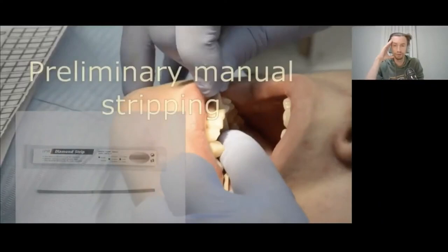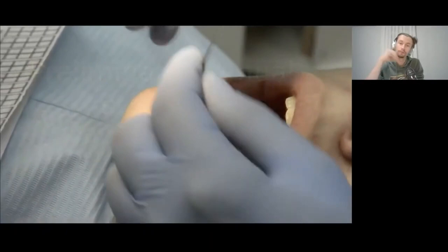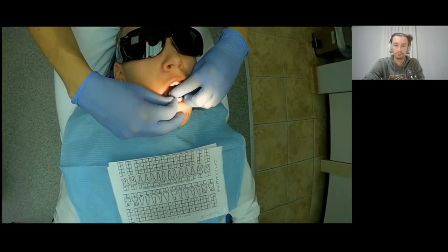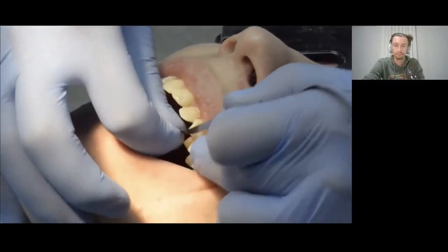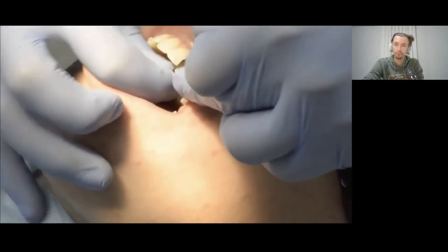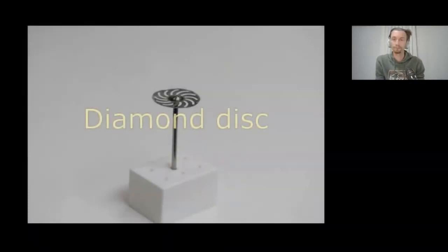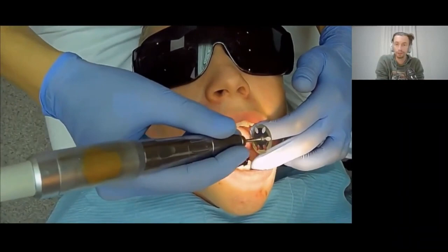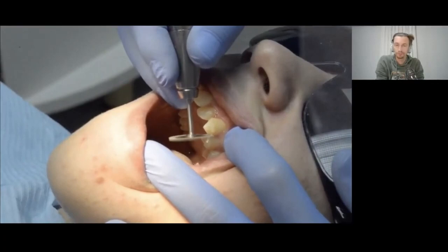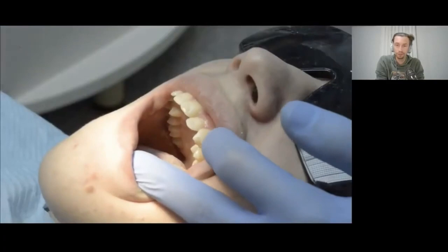Let's have a look at a short video I recorded in the clinic. I place the patient in the supine position, I'm at 12 o'clock, and I put the IPR card on the patient's chest as a stripping guide. I start to perform stripping with strips just to open the contacts. If I have to remove a larger amount of enamel, I use discs and burs — for example, here I needed to strip the distal part of the canine and used a disc.